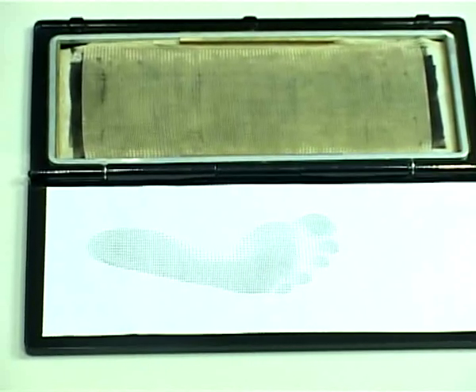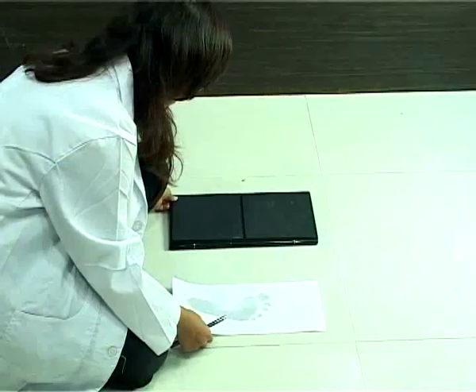Gray scale image — darker areas indicate higher pressure.